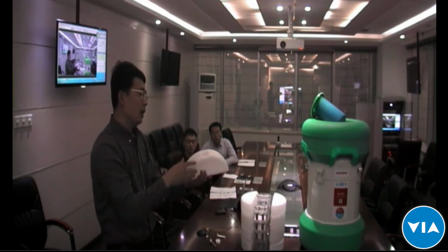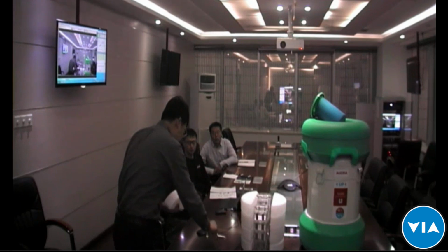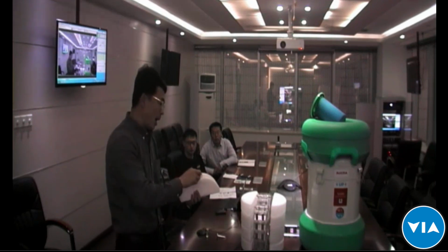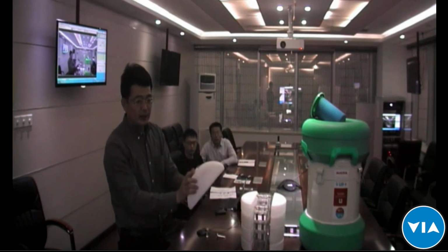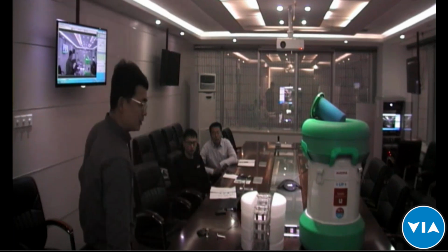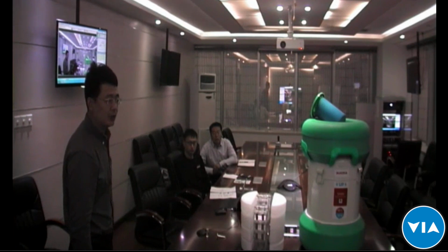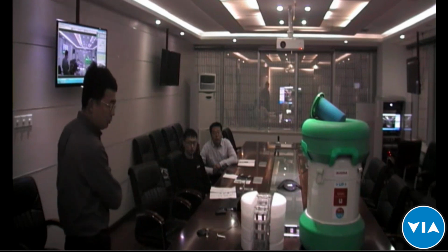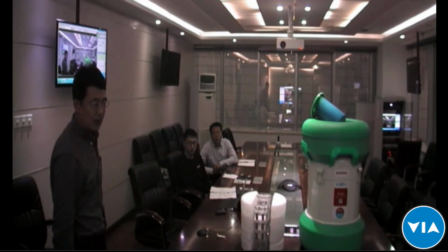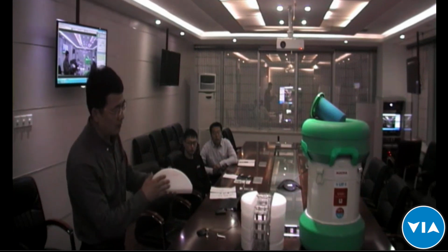After the water is filled into the ice blocks, we need to screw the thermometer and the cap into the ice blocks, and then place the ice blocks into a separate freezer. The freezer is just a typical freezer at minus 5 to minus 20 degrees C. We place the ice blocks in the freezer to freeze them. It needs up to 48 hours to freeze the ice blocks.